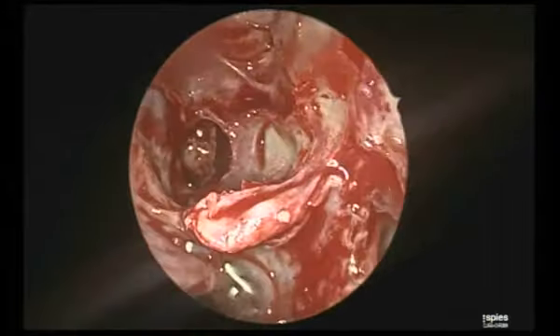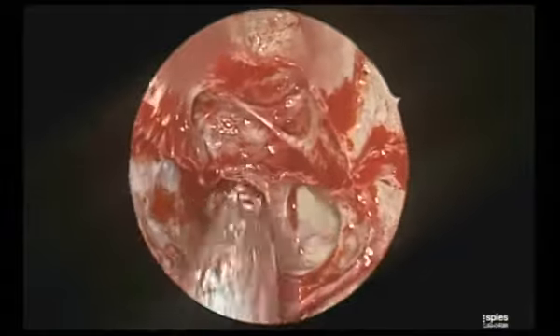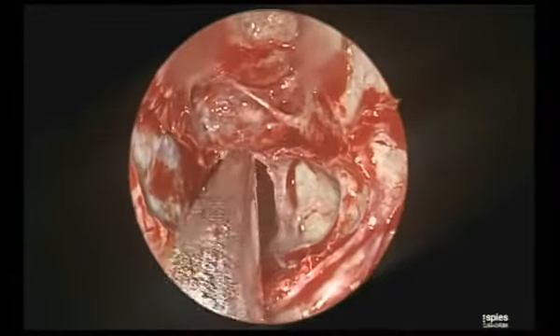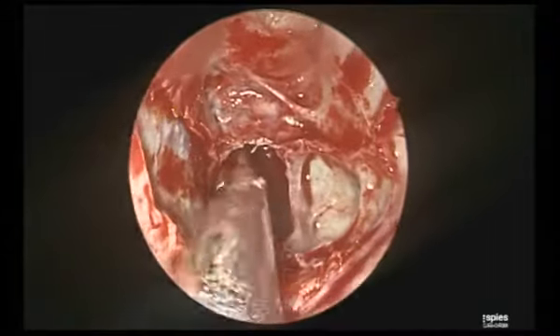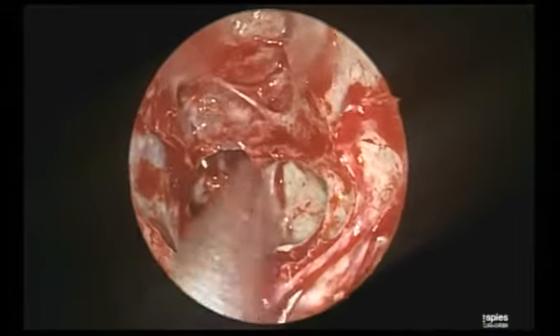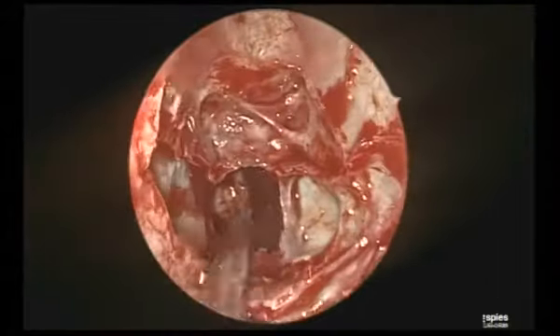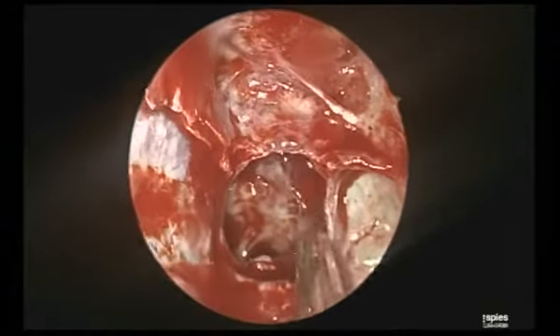Satish, you can also show the audience the posterior ethmoid artery. If it is visible, I will. That depends upon the thickness of the post-ethmoid skull base. The post-ethmoidal skull base is relatively thicker than the anterior ethmoidal skull base. So generally, this artery passes through the thickness of the bone and we don't see it. Sometimes if the post-ethmoidal skull base is not very thick, then you can of course see the artery running underneath.